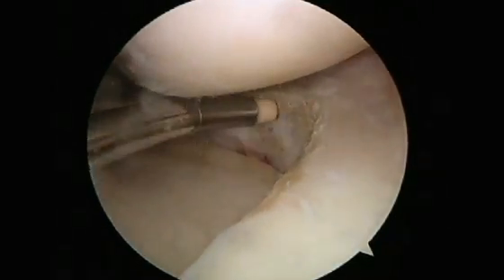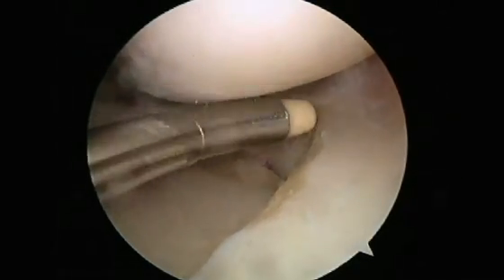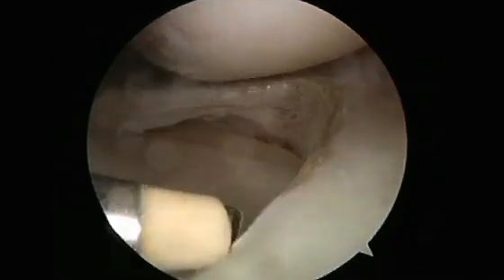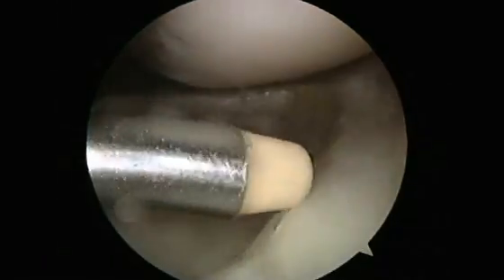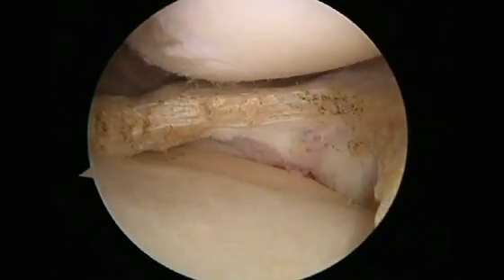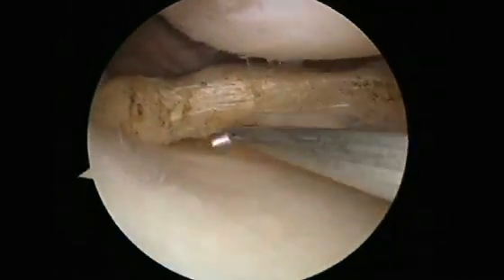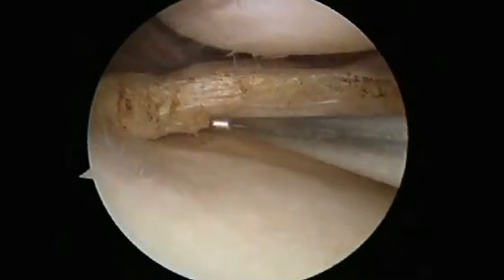And it's important to smooth the rim to make a smooth transition between the formerly torn part of the meniscus and the normal meniscus. Also if there's any roughening or fraying of the joint surface cartilage — or the surface of the joint like the gray material on the end of a chicken bone — that type of cartilage material, it's helpful to smooth that out in addition.